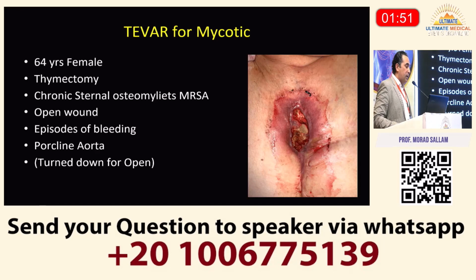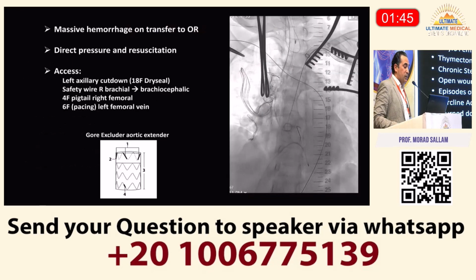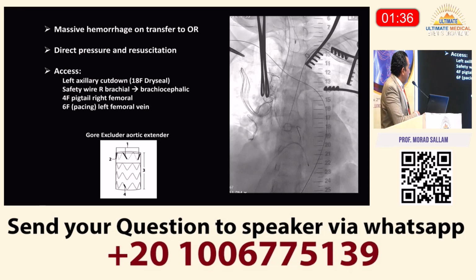Another one is a TEVAR for a mycotic aneurysm, and this is a little bit unusual. 64, female, thymectomy, chronic sternal osteomyelitis, and with an open wound. As you can see, this sinus was bleeding all the way to theater, ended up being done as a semi-emergency with a bit of compression on the floor. And we decided here to go with a Gore abdominal cuff. So we used an excluder, 45 millimeters, just because of the length from the coronaries to the innominate.